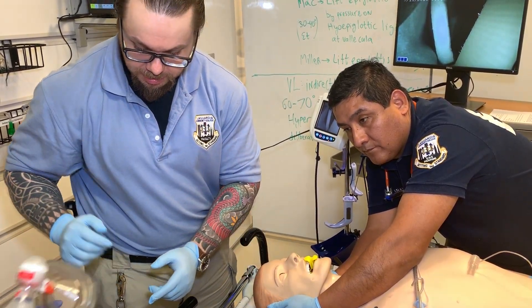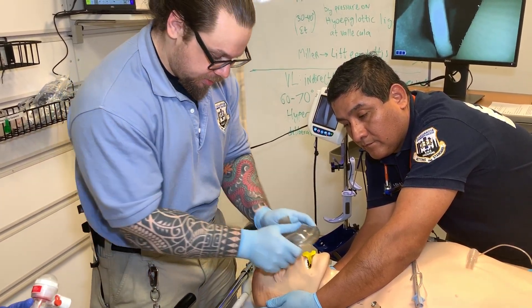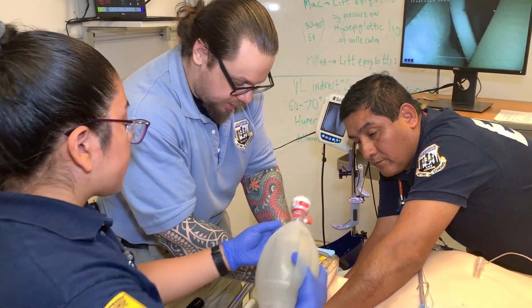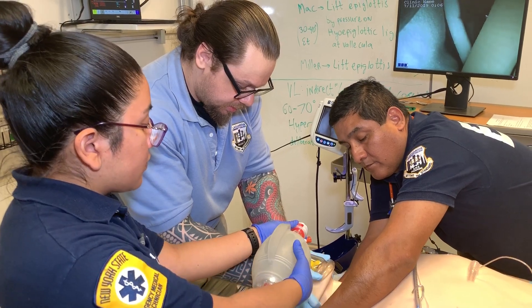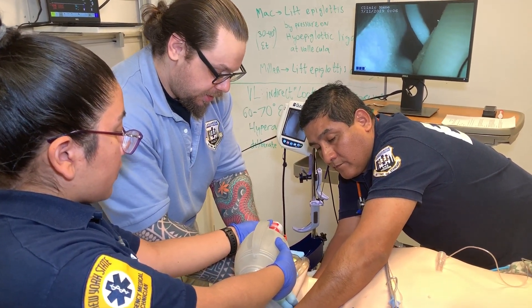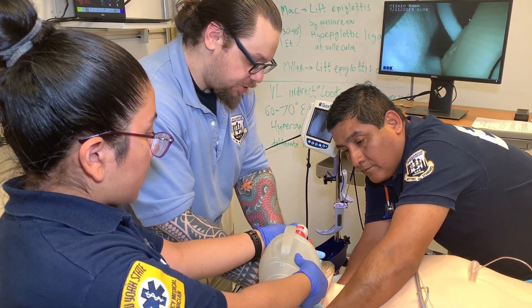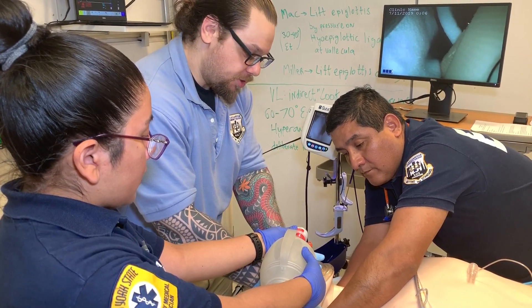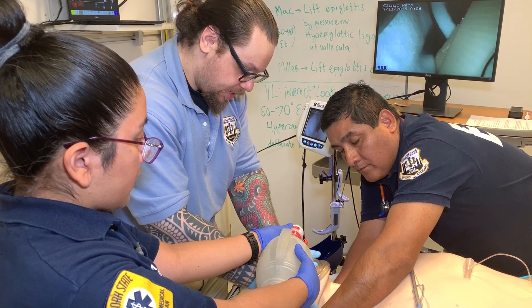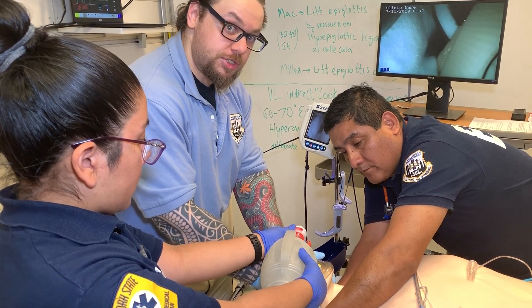Now if I'm going to pre-oxygenate them, I would take the mask and apply a jaw thrust like so, and my partner is going to connect and ventilate — one breath every five to six seconds when pre-oxygenating. Important here is that you may not have enough strength to maintain this for a prolonged period of time, so right before six seconds I'm going to engage it. I'll count: two one-thousand, three one-thousand, four one-thousand, five one-thousand, six — I engage the mandible right before she squeezes.